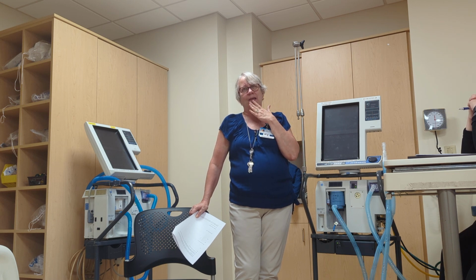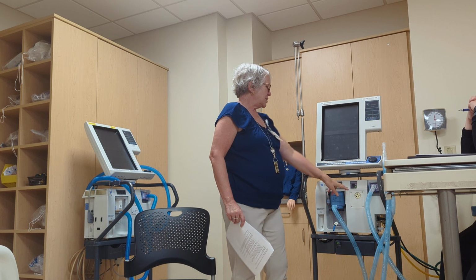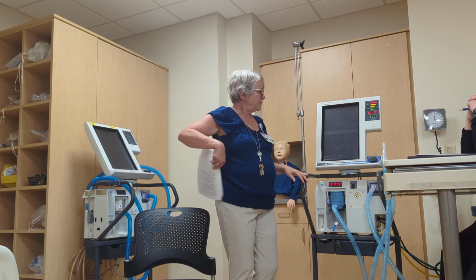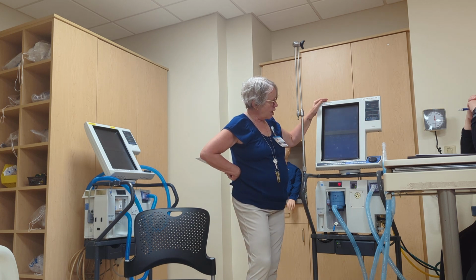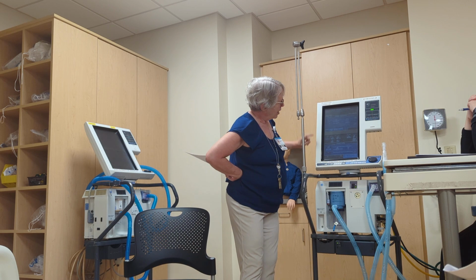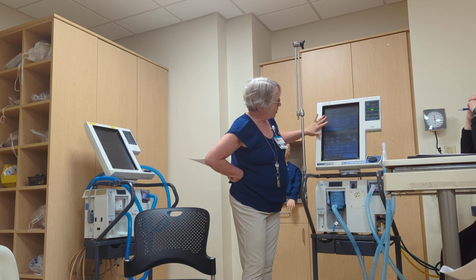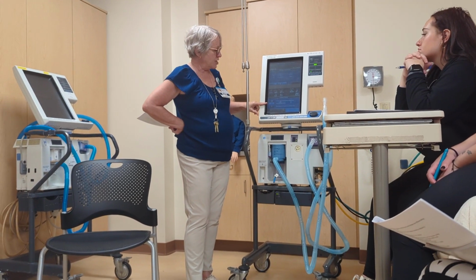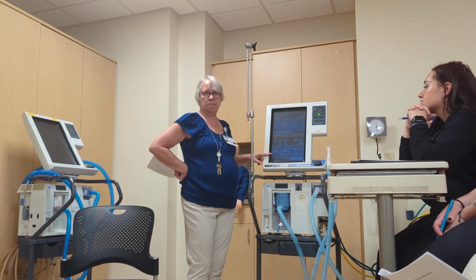To do an SST, you turn your ventilator on, and it usually will come up on your home screen. Look, here's my PB840. It says same patient, new patient, SST.